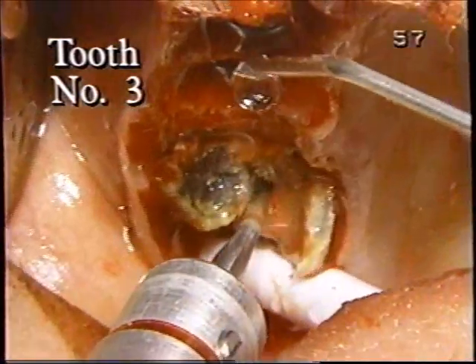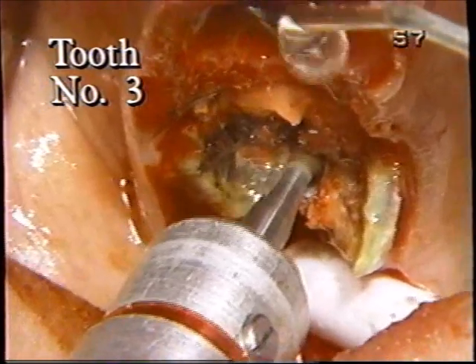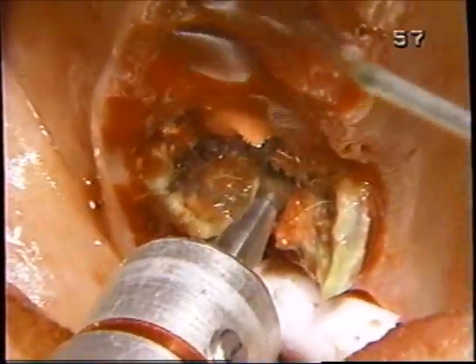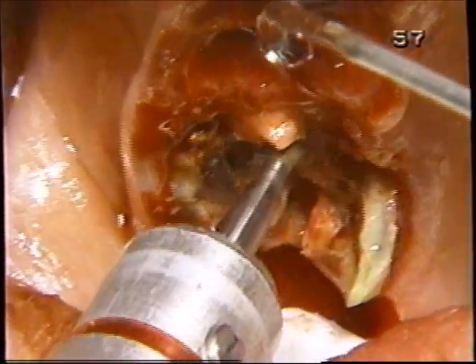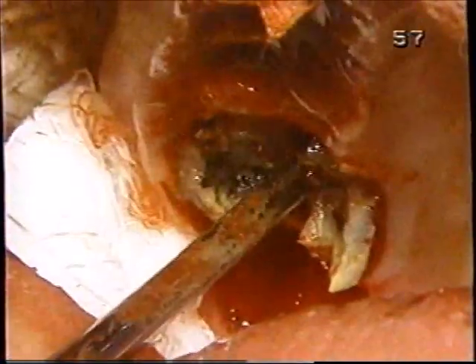What we're doing is cutting a dead tooth in half. I'm going through the furcation. I'm separating the palatal root from the 2 buccal roots, and I'm going to try to remove the buccals at one time and the palatal one intact.